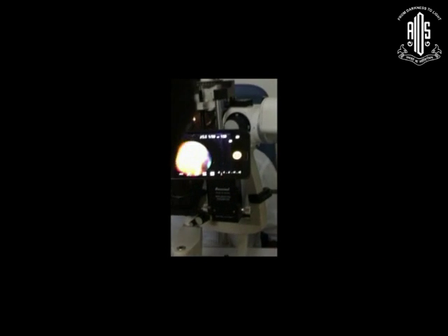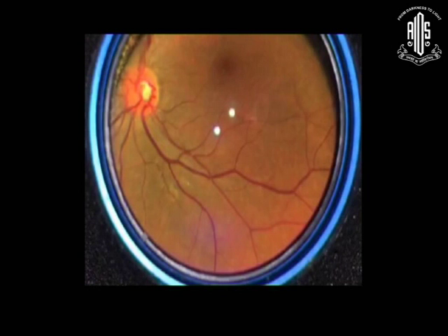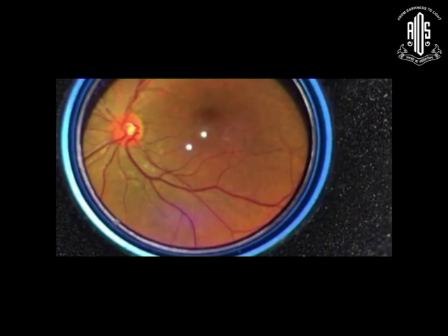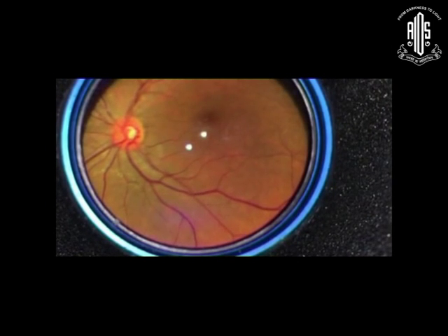And this is the way you mount it on the slit lamp, and you can take pictures by touch focus and capture them on the phone itself. This becomes a little more stable because you are having a support, whereas the handheld needs a little more learning curve. There are a couple of videos taken by Dr. Raju with the 28 diopter lens on an iPhone. You can see the venous pulsations here if you look carefully, and there's a venous loop here.